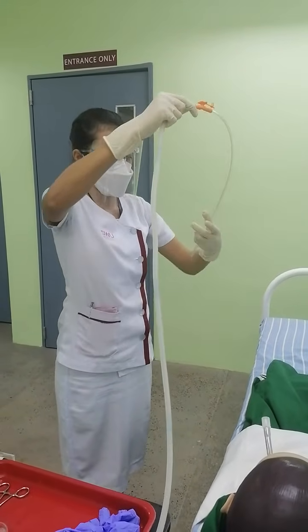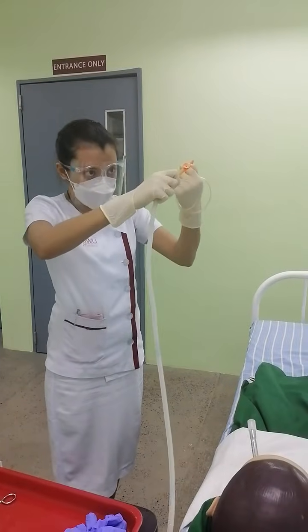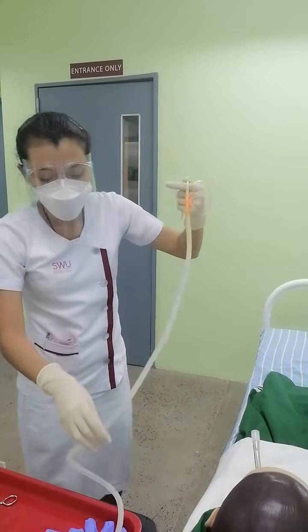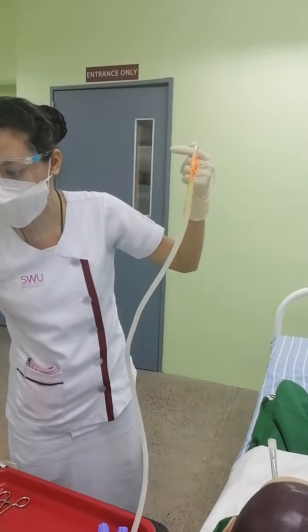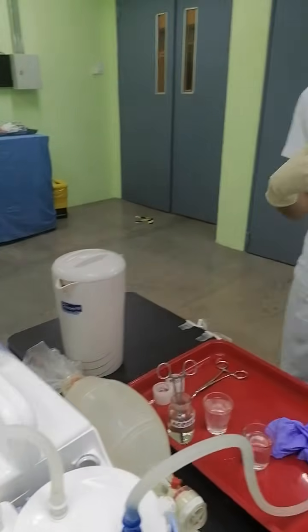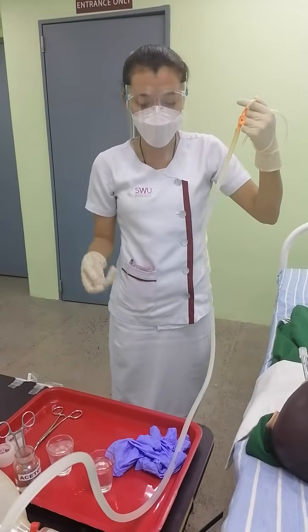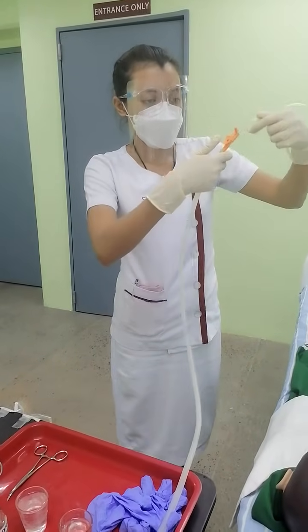I have coiled the catheter first in order to turn on the suction machine. The purpose of connecting these two is to ensure that during the procedure, the connection is well secured. I am touching the suction machine with my non-sterile hand. Then I will suction the tip of the catheter into the normal saline solution in order for it to be lubricated, to check its functionality, and to check if there are any holes.